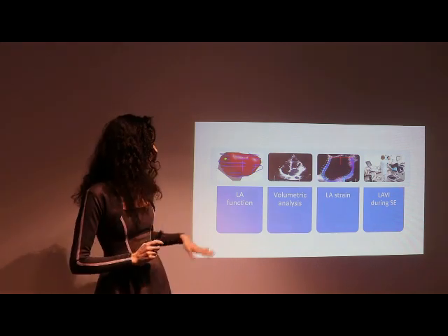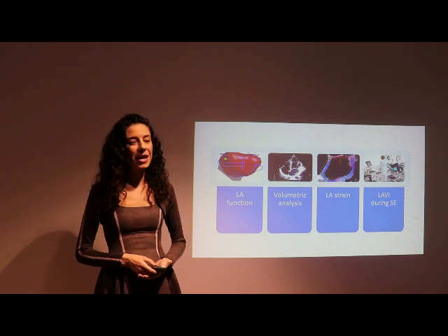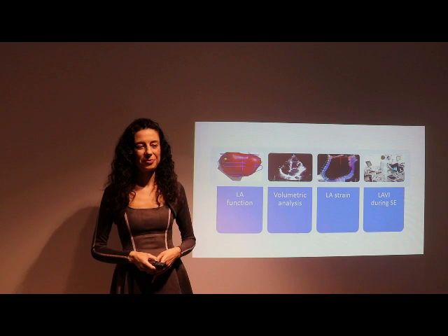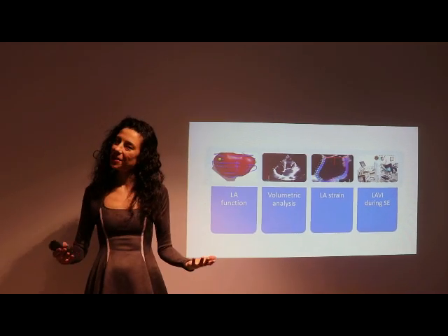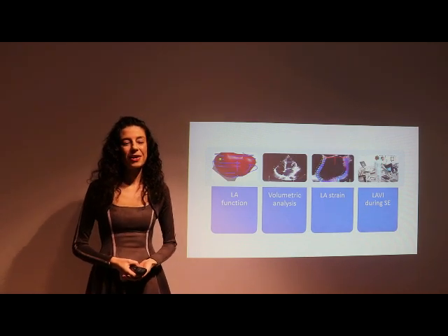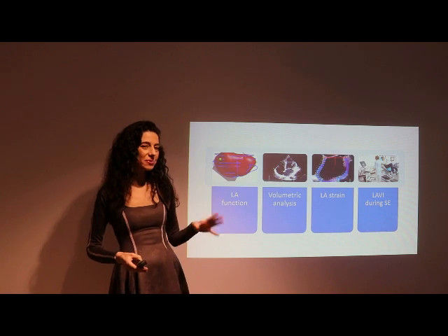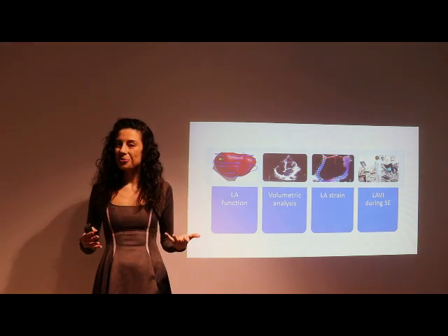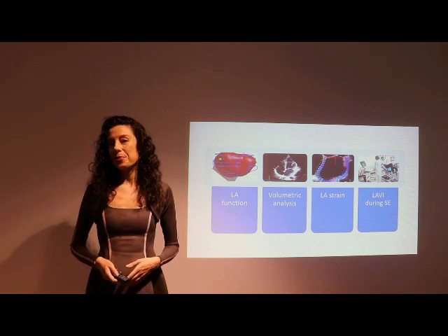The first thing is a little bit about the function of the left atrium, then about the volumetric analysis of the left atrium. Then comes the strain of the left atrium, and here we have new things that are very important, and last but not least a couple of slides about the usefulness of measuring left atrial volume index during stress echocardiography.